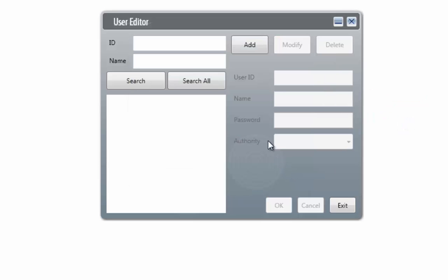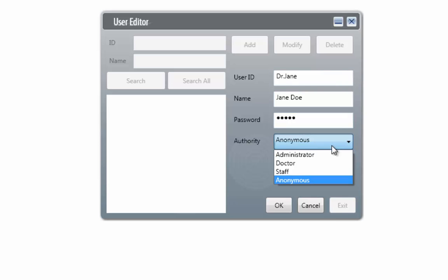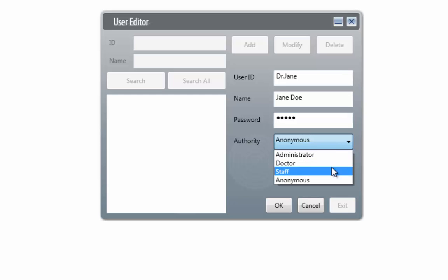To create a user, click on the Add button, then enter the user ID, name, password, and finally, select the authority level for this particular account. Each authority has its own limitations on certain uses of features. Specific details are listed here.